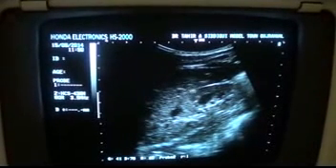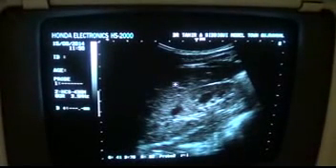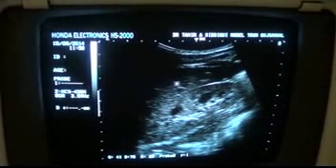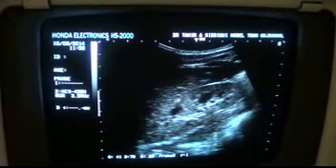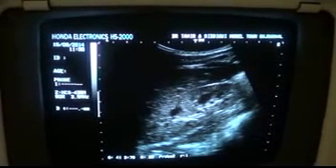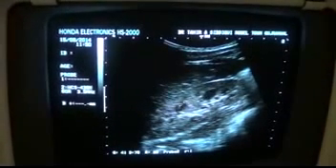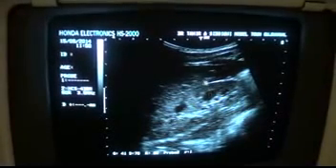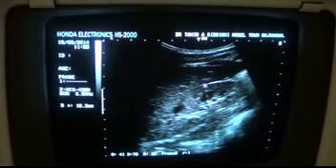First, I should tell you that normal is that, provided, number one, the most important thing, provided the liver is normal, then in that case the echogenicity of the liver parenchyma. Now this is the cortex below the capsule, this is the cortex of the kidney, and you can see these are the pyramids, and if we combine both these, this becomes the parenchyma of the kidney.